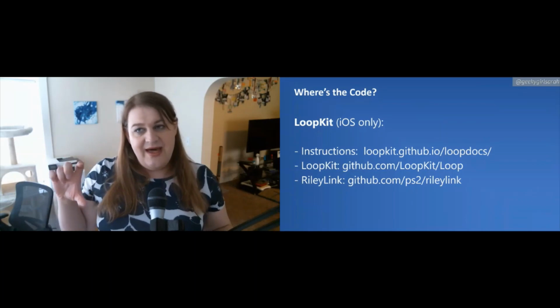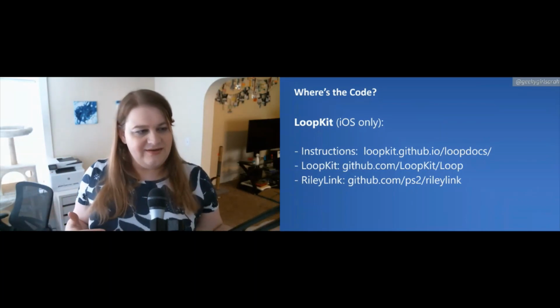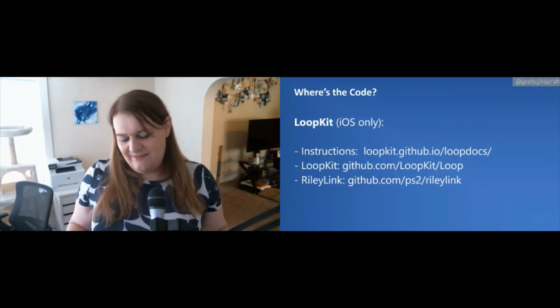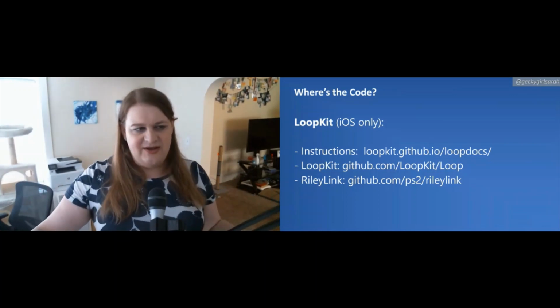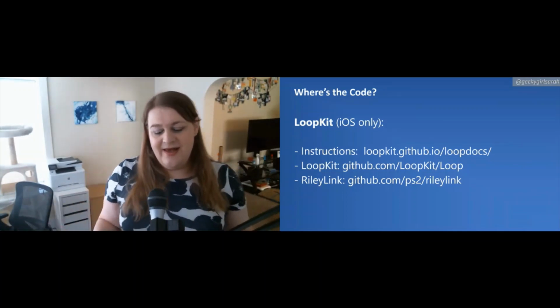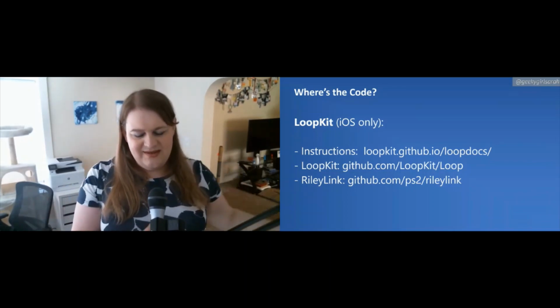RileyLink, which was that Bluetooth board, is also open source. The guy named it after his diabetic daughter, which I thought was cute. But he pushes all the hardware stuff online. You can also just buy the board. And these are actively maintained projects. They're constantly getting updates by all sorts of people. It's actually really refreshing to see a really good open source project not just get abandoned.